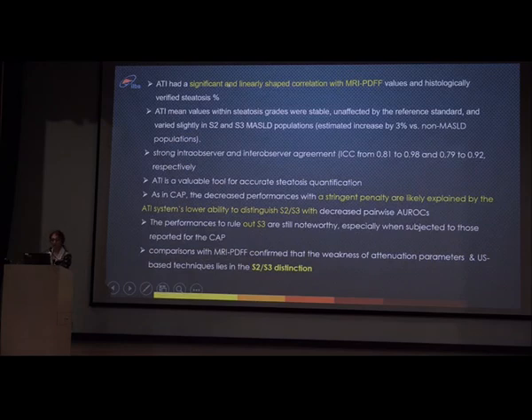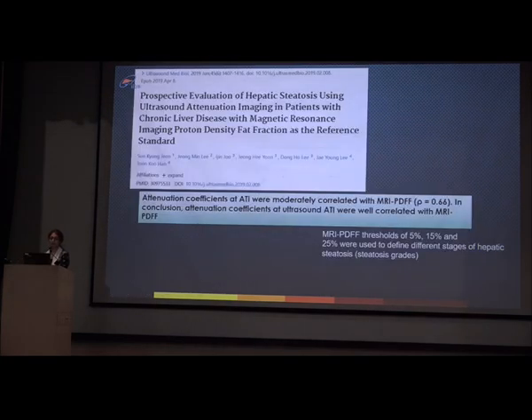What did the study tell us? That there is a significant correlation with MR-PDFF values and histologically valued steatosis. There was good intra-observer variation, good agreement, in the S2 and S3 population. So the only issue with this modality, like any other modality, is that when you have to talk about moderate and severe, the differentiation between moderate and severe is not as good as the differentiation between an S0 and an S1 or an S1 and an S2. S2, S3 distinction is still a bit of a gray zone, but nevertheless, to rule out S3, it is a great modality, in comparison with the MR.